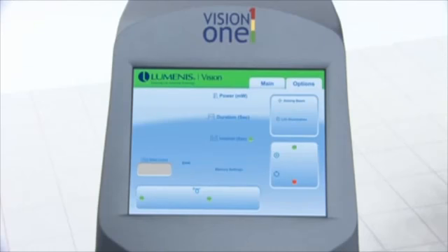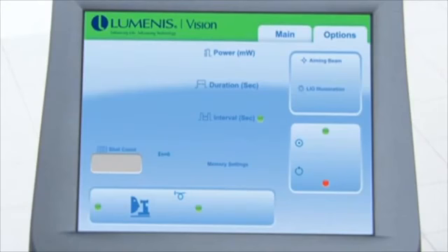When a delivery device is properly connected, the corresponding icon displays on the control screen and remote control. The LaserLink Z or InSight, the Aculite endoprobe, the Heine LIO or Keeler LIO. An X on the display screen means no delivery device is connected.